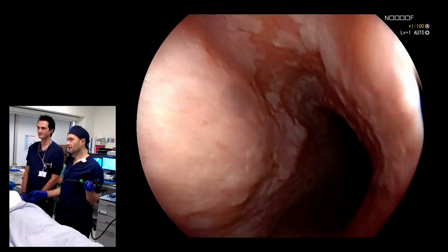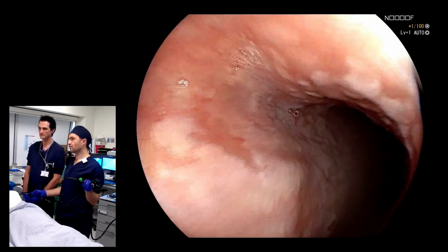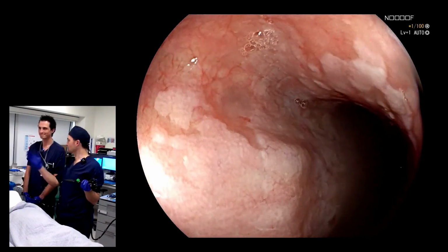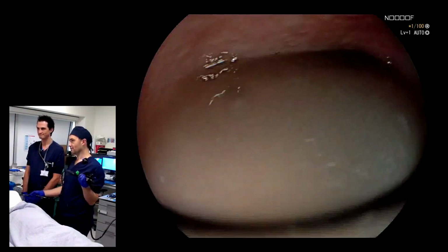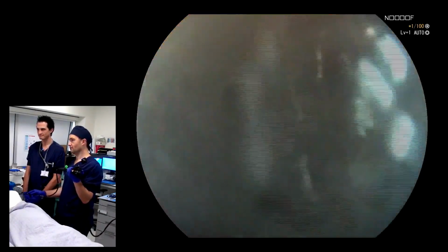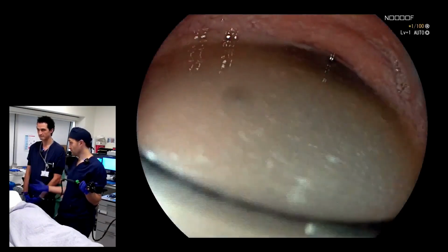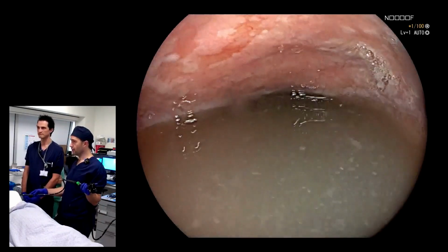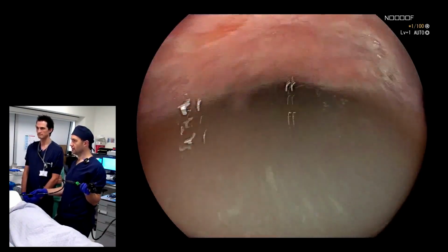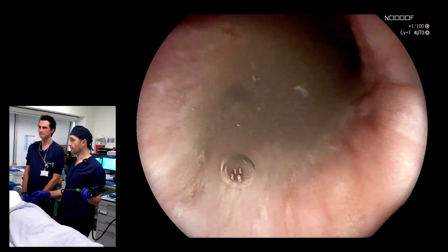And then you have this very interesting appearance that starts here. You might think, well, this is Barrett's esophagus, right? This is for sure easy to confuse with Barrett's esophagus. It looks a bit like it. As we come down more, we have a lot of fluid. The presence of fluid and this degree of fluid stasis in an esophagus in a patient who has fasted acceptably is not normal. So that's one thing: the stasis of saliva, the stasis of fluid, and also the stasis of food, and there is food matter here.